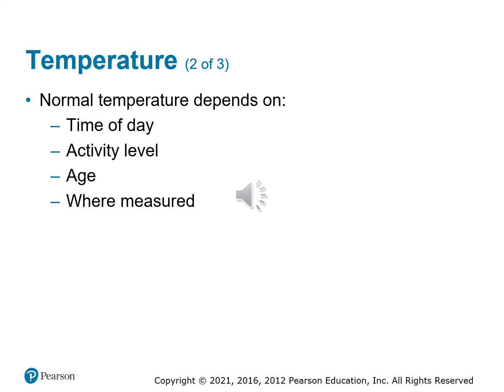But if you measure a temperature axillary, which is going to be under the arm, it's usually going to be a little bit lower than what the actual temperature is. Not to say it's not a good tool to utilize, but just understand that it's going to cause that normal temperature to fluctuate a little bit. So there are variables with this. Again, common sense goes a long ways, and just understand that you have to use all of the tools of the assessment to determine how significant your patient's illness is.